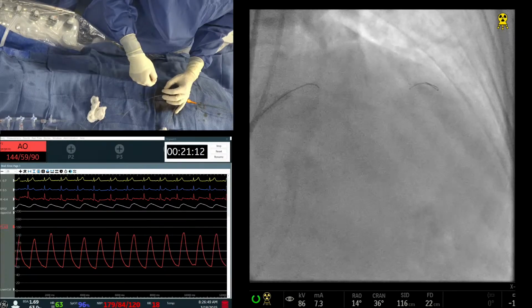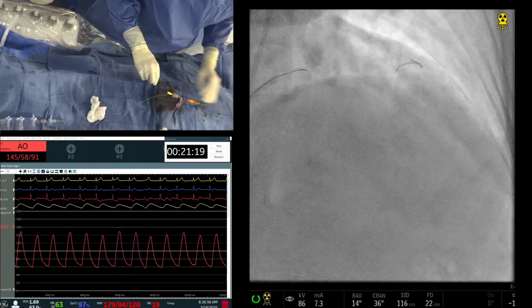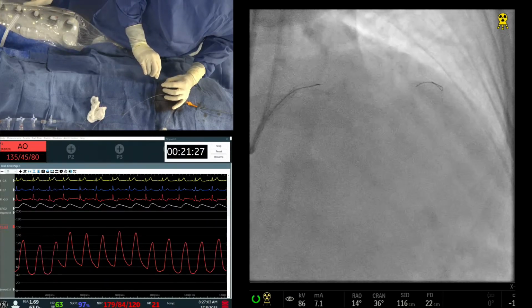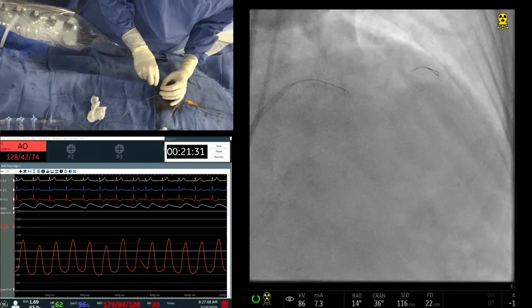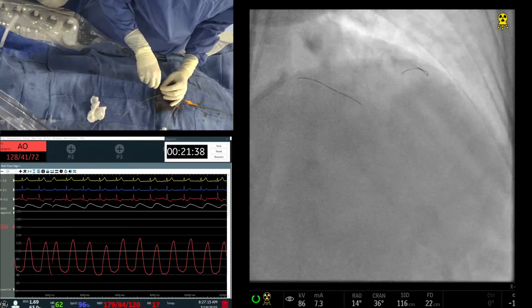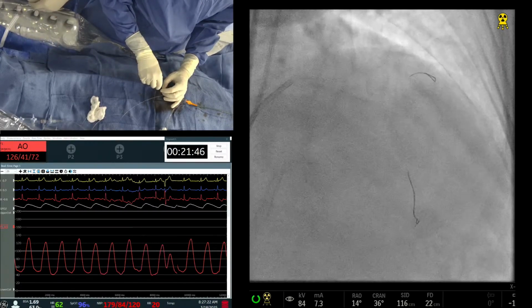That crack in the calcium is what you want. Go to diagonal and we'll go to the, where is the Fielder wire we have? Go to the LAD. So that's all we need, because that's our goal, a crack in the calcium basically. We need to see the machine. Bring it this way. Good. You want to see a little dye? No, it's okay. Good. Okay, excellent job again. So this is the run-through wire being advanced into the LAD.